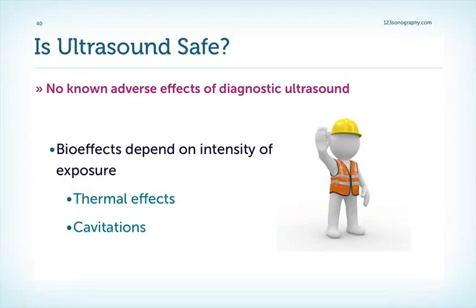And why are these factors of concern in the first place? Well, simply because ultrasound should be safe. And we know that ultrasound causes bioeffects, and that these bioeffects depend on the intensity of exposure. We can note thermal effects and also cavitations, little gas explosions which occur within the blood. You'll hear more about cavitations when we talk about prosthetic valve disease. But you can be reassured that ultrasound is safe. There are no reports of adverse effects.